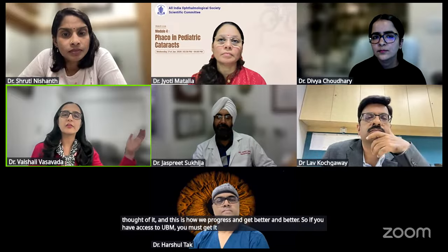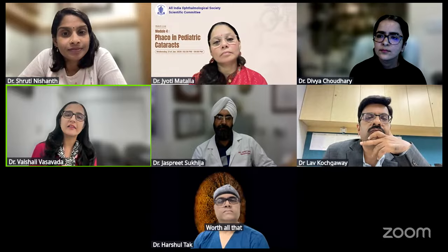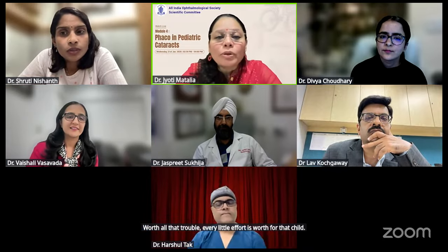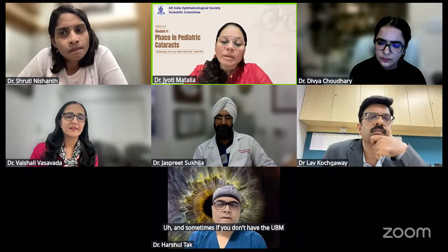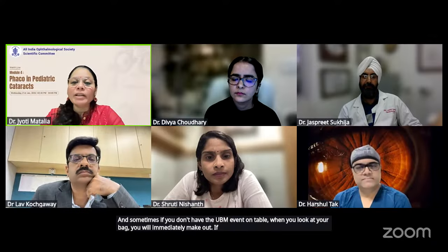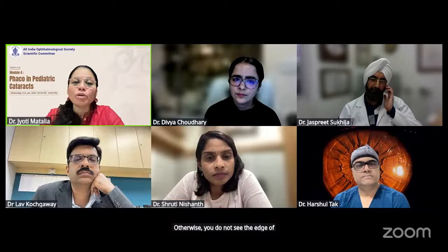Yeah, it's a hassle to get it up in the OR under EUA, but it's worth all that trouble. Every little effort is worth it for that child. And sometimes if you don't have the UBM even on the table, when you look at your bag, you will immediately make out if the edge of your bag is within your pupillary edge. Otherwise, you do not see the edge of the lens bag. That means you know it is adequate enough.